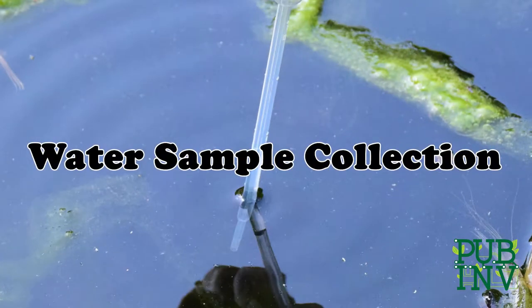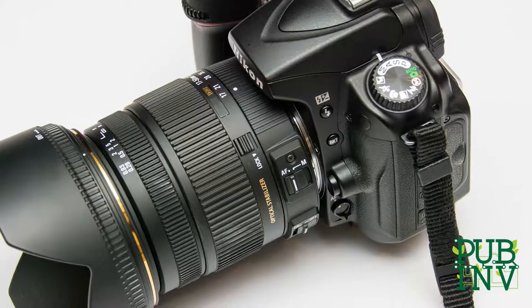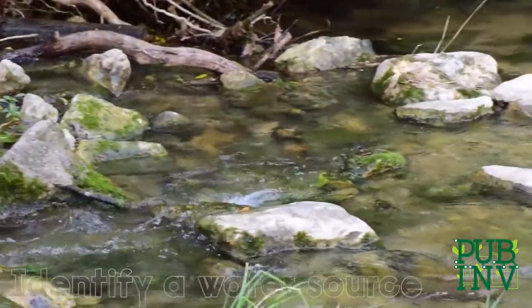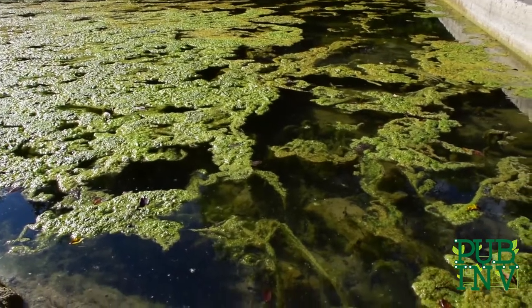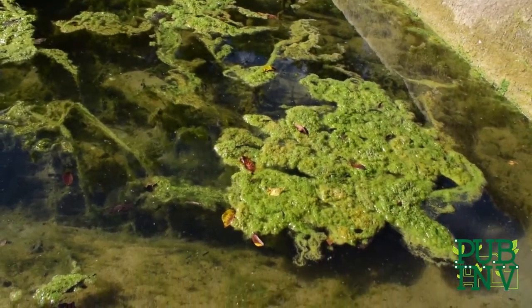Step 1 is water sample collection. For this step, you'll need the 2 mL sample vials, 1 pair of gloves, your permanent marker, and a camera. First, you want to identify a local body of water that you would like to use for your test. This can be a nearby pond, a creek, or a slow flowing river. Just make sure it's easily accessible.